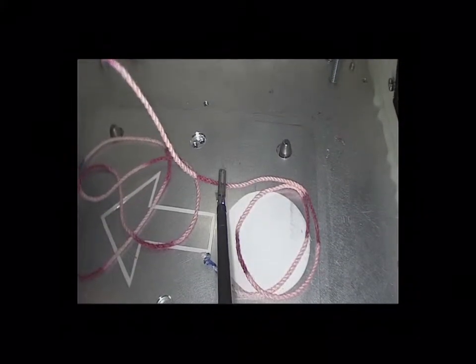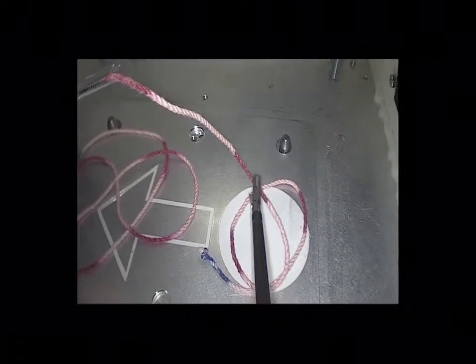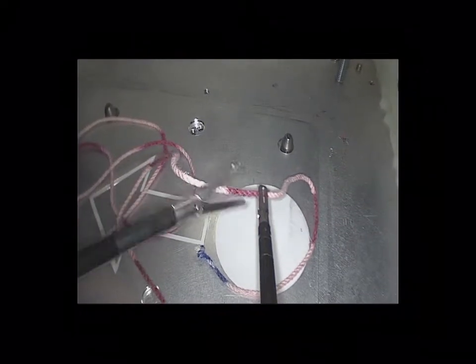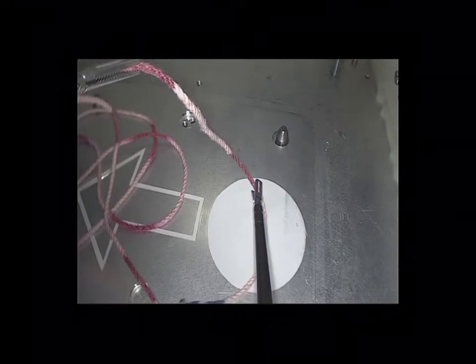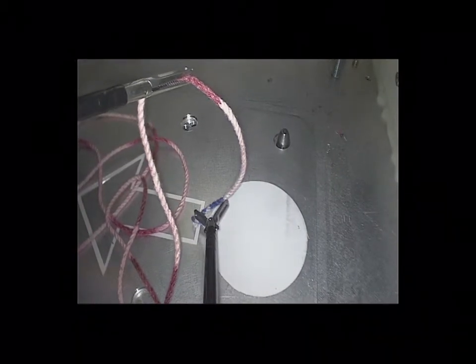Remember: don't hurry, but don't commit any errors. This drill more closely simulates running the bowel in the minimally invasive setting, making sure that you capture all of the designated areas, and you stop when you touch the final one, like so.